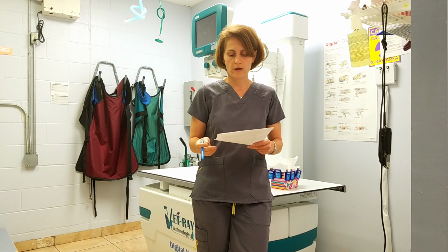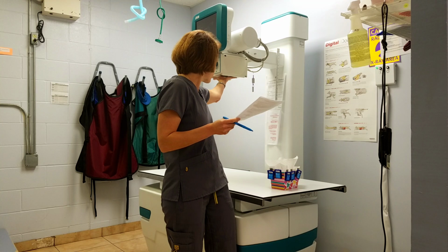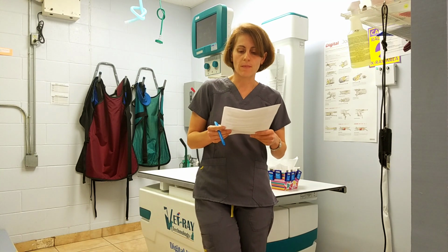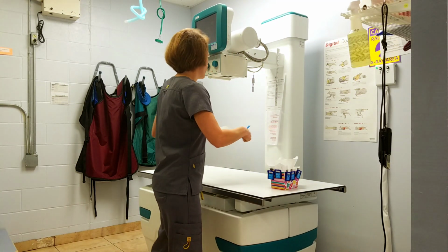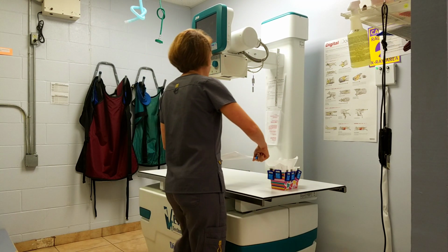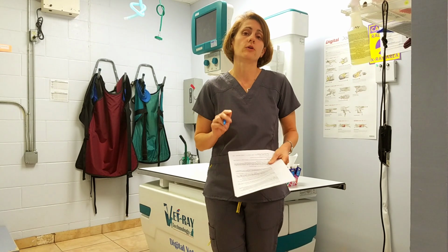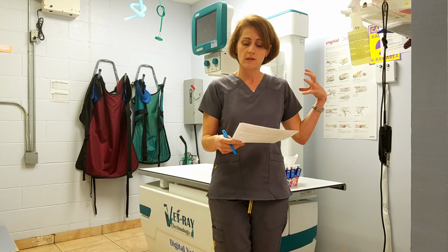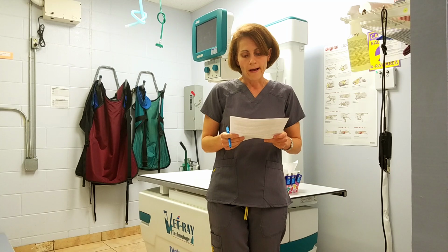The holding of animals, x-ray tubes and films. So we're on to number 3. You should never be touching the x-ray tube, which is this. You shouldn't be touching that when you're shooting x-rays. If you are holding an animal down, you should never be standing directly below the tube. You should be standing to one side, which means on this table, you will need 2 people or you will need a sedated pet. One person should not be shooting one x-ray because you're standing right by the tube, which is where the x-rays are generated. That increases your exposure.